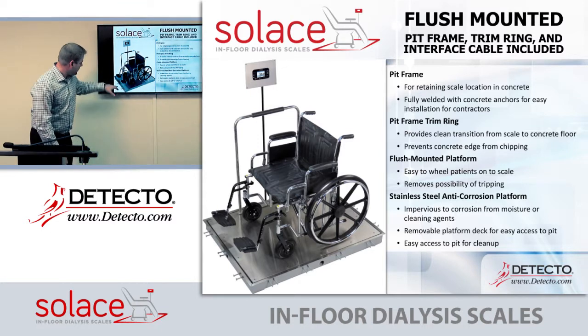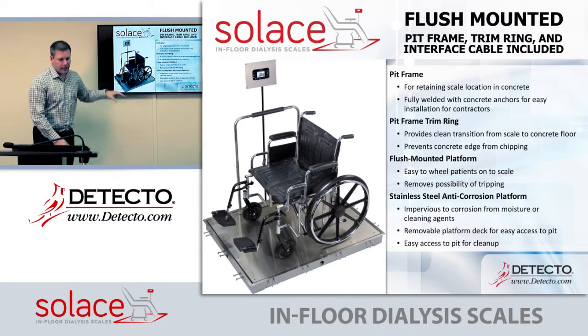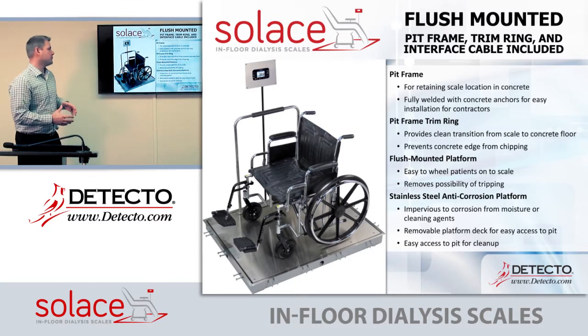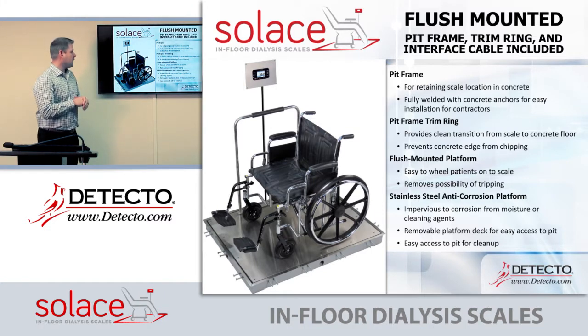Here is a cutout showing the scale without concrete around it. It comes with a pit frame, a stainless steel deck, and a trim ring around the scale. The pit frame acts as a form for the concrete and also as a locator for the scale once the concrete has been poured. The frame is fully welded and assembled — the contractor simply places it where the scale will go and pours the concrete around the pit frame.